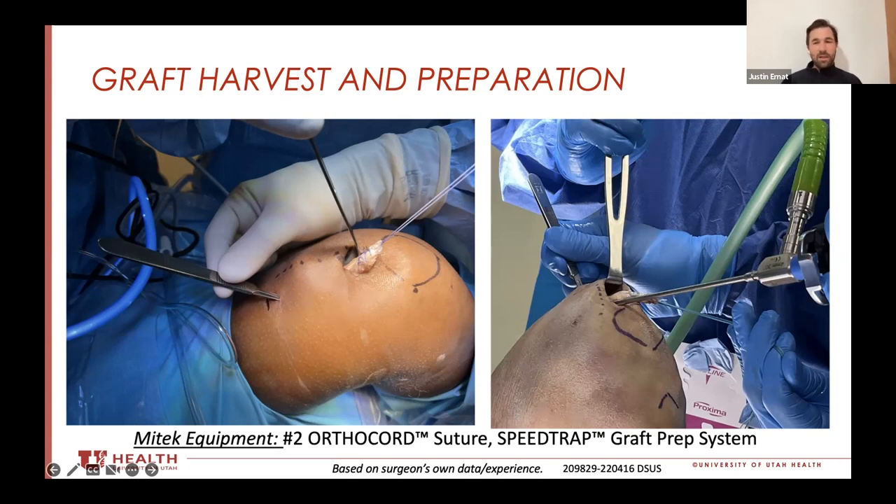He was opening this several-hundred-dollar disposable device simply to make one little cut, and that seemed silly to me. Everything else I have to give credit to someone else — it was just making that little percutaneous incision that was the lightbulb moment: 'Holy cow, this is so easy, and you don't need anything special.'